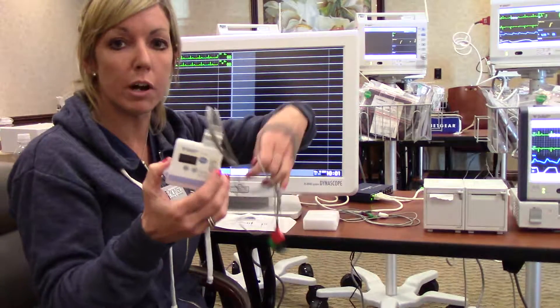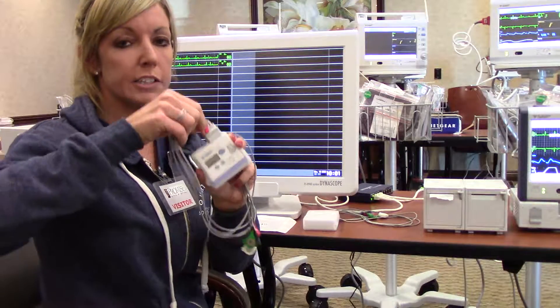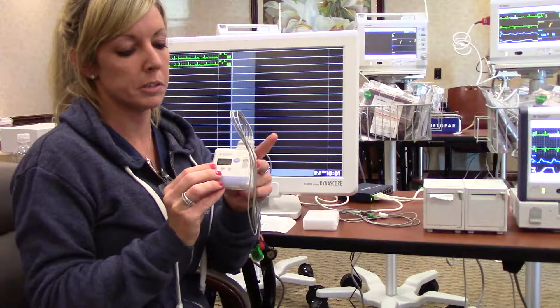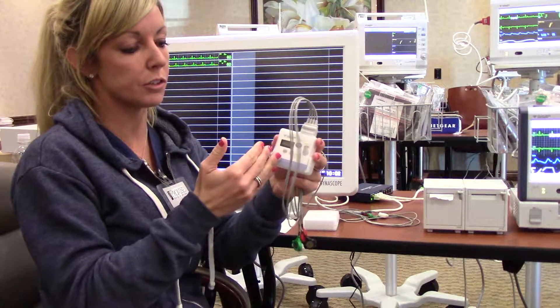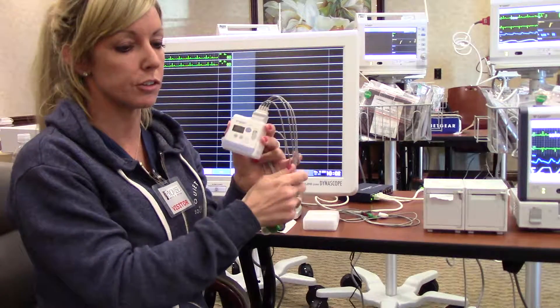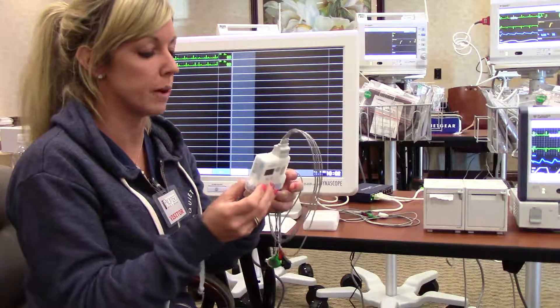The unit is waterproof. The patient can shower with the device on as long as the EKG leads are connected to the unit. The battery life is five days. You will get a battery light warning as the battery life is decreasing — the indicator on your screen will prompt you to change the battery. As well as at the central monitoring unit, you will get a warning on the display screen to change your battery.